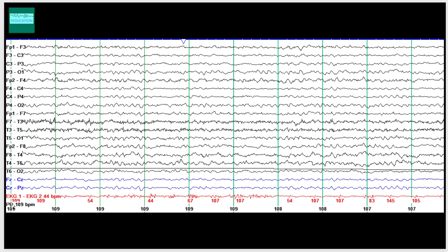Even before that, do you see any alpha rhythm? Let's look at P3O1 first. How many waves can you count here? 1, 2, 3, 4, 5, 6, 7-ish, 8-ish probably. But this does not continue in the rest of the channel.